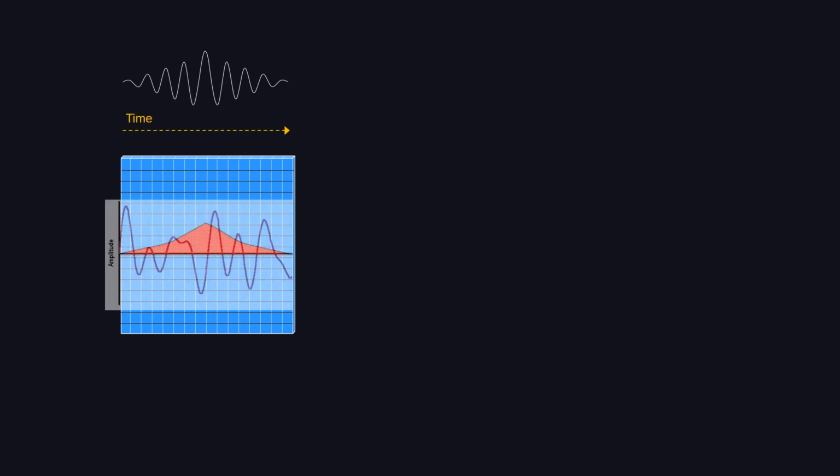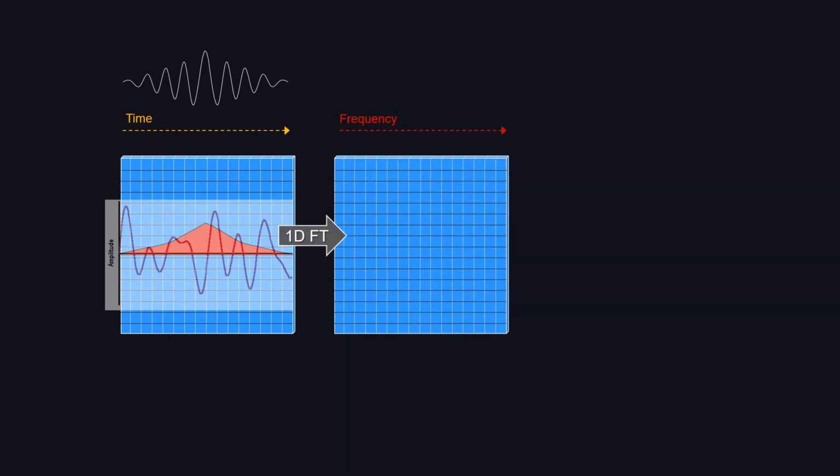So let's put things together one more time. We have done our slice selection step, and here we have a single cross-section slice, and we are going to sample the signal echo and fill in the K-space. Initially, we have a complex summation signal as we sample the echo. We then do our frequency encoding steps in the x-axis and Fourier transform.